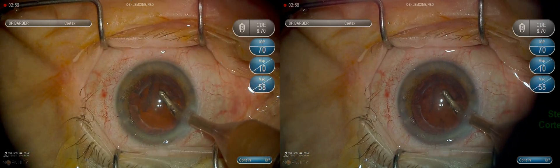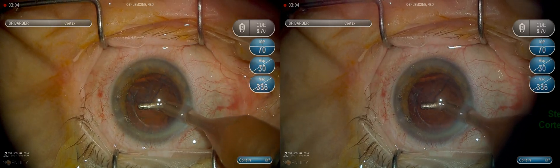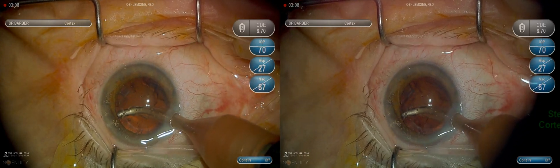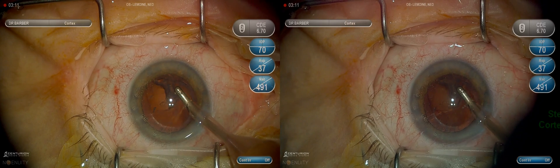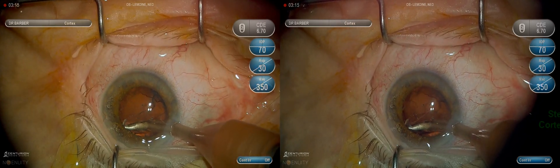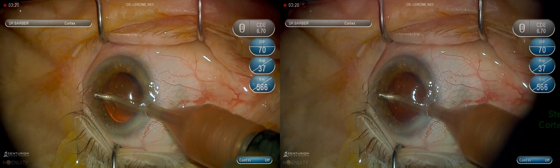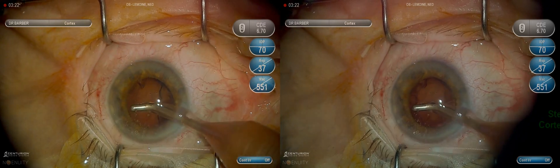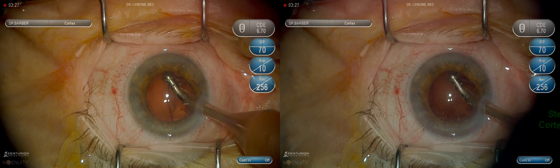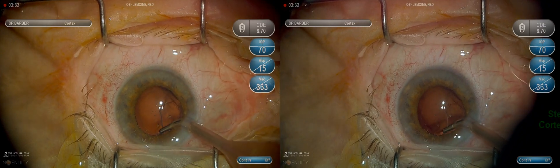This is a 45-degree irrigation aspiration tip, stripping the cortex towards the center. You can see the vacuum building to just under 600. Left the sub-incisional cortex for last. This is rotating the 45-degree tip posteriorly and then bringing it laterally as I strip it towards the center.